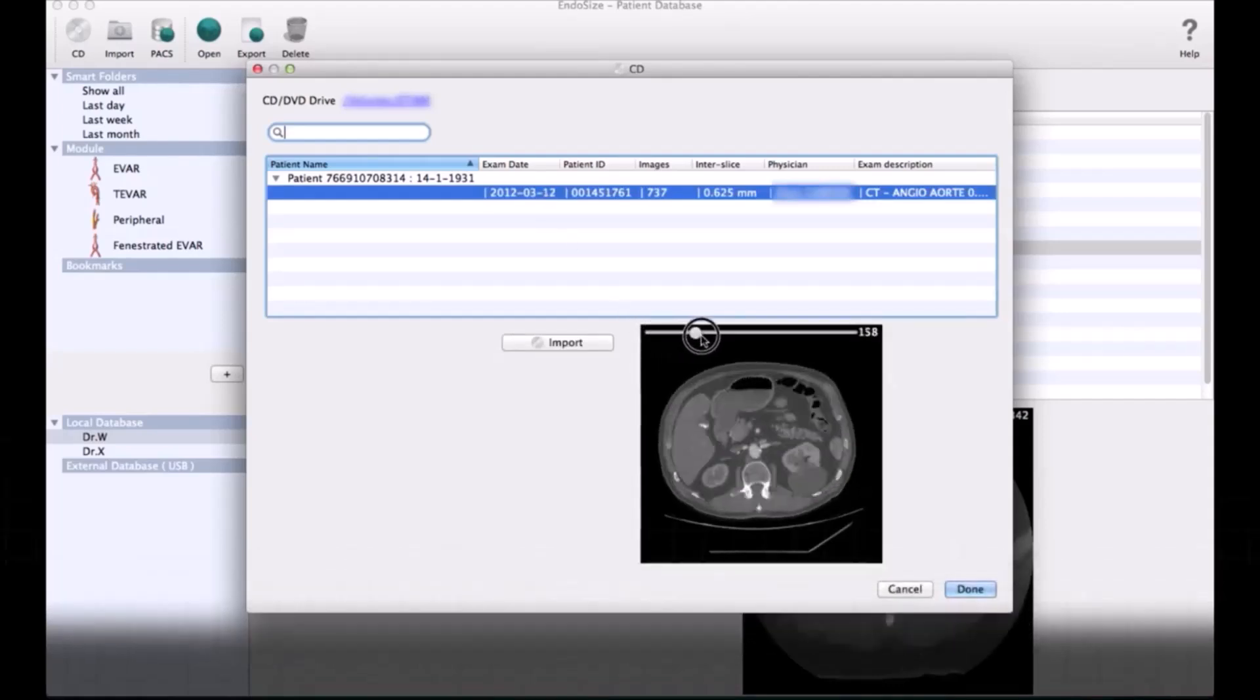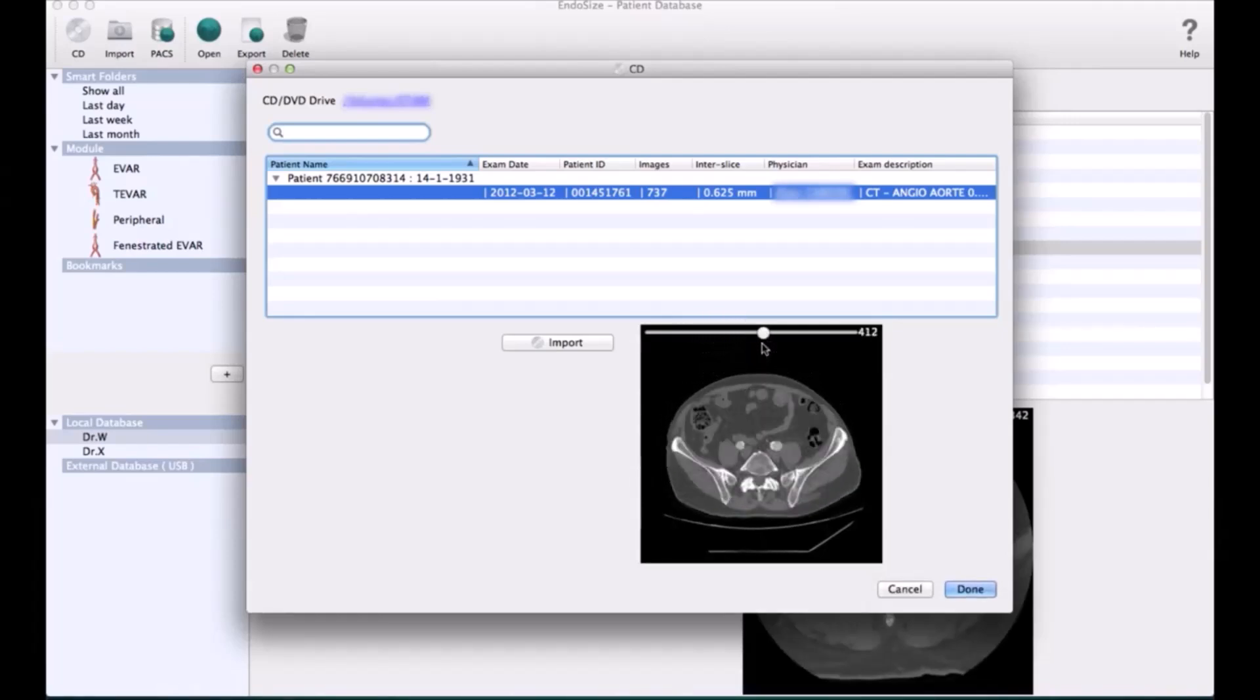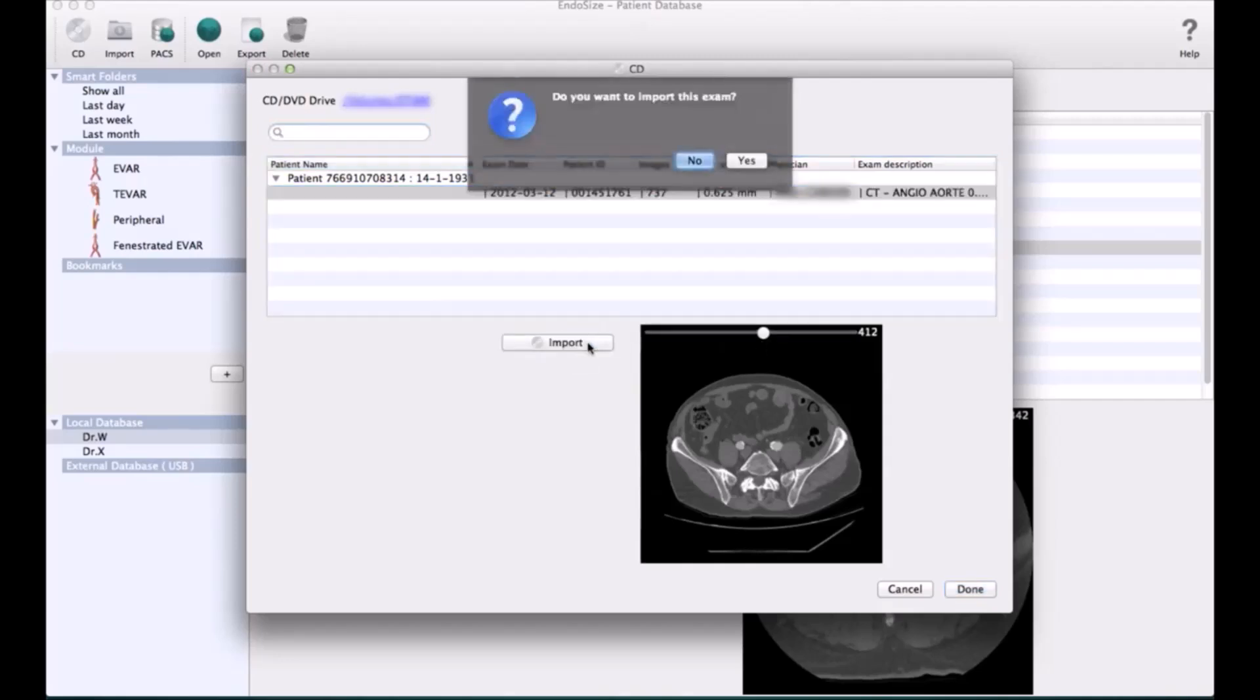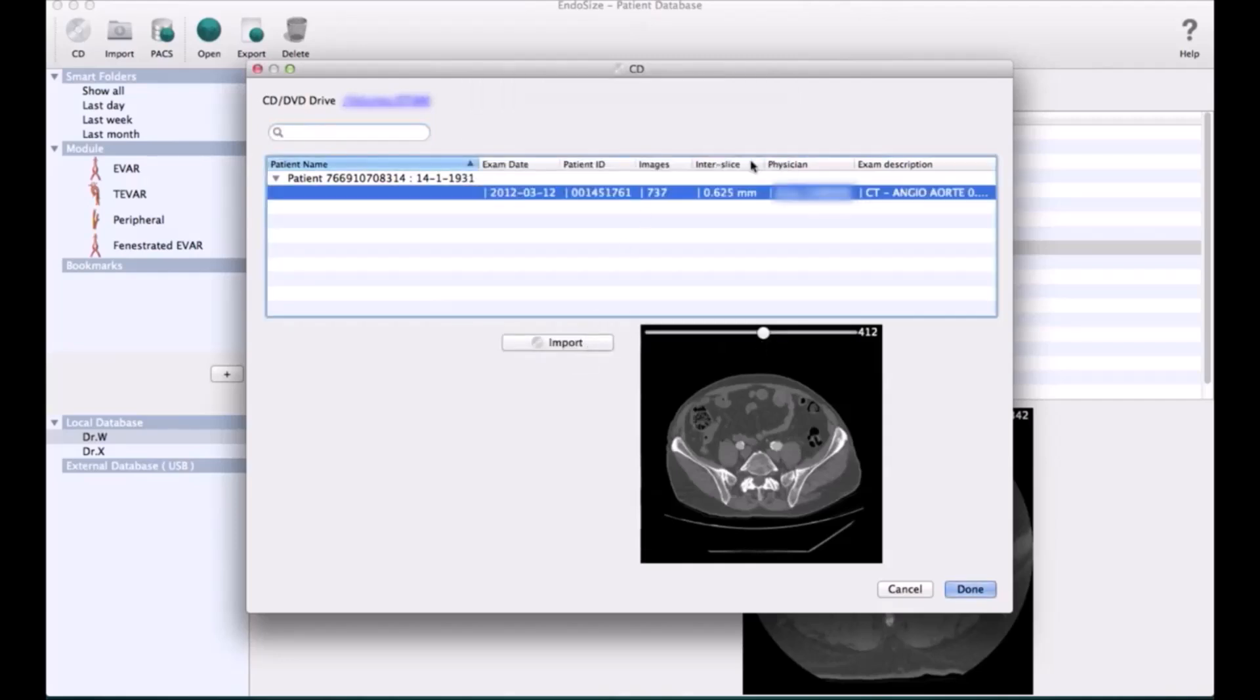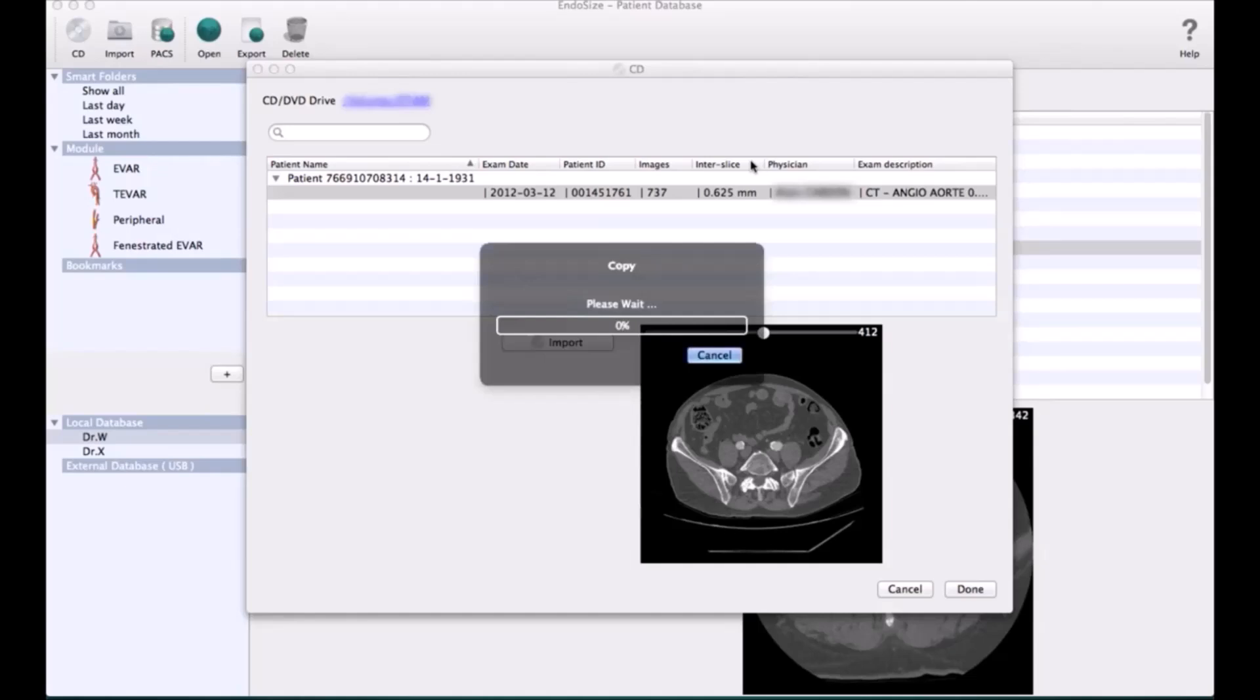After it's imported, you need to put three points, what is called P1, P7, and P8. You confirm that this is the loop that you want to import.